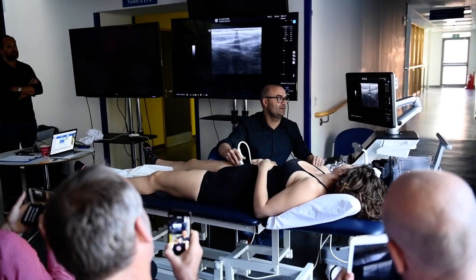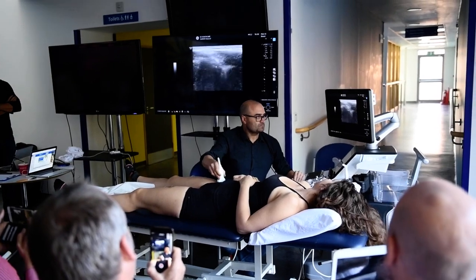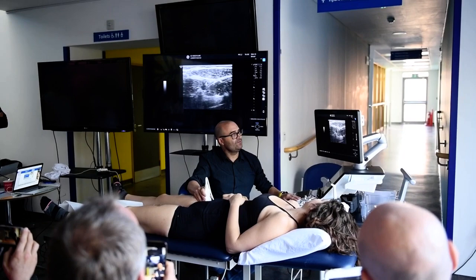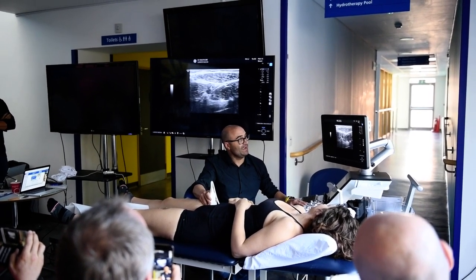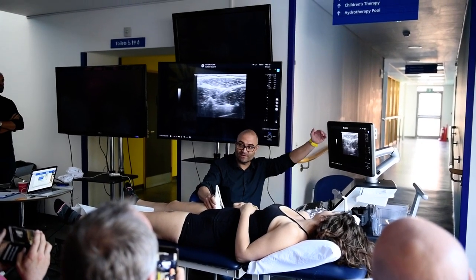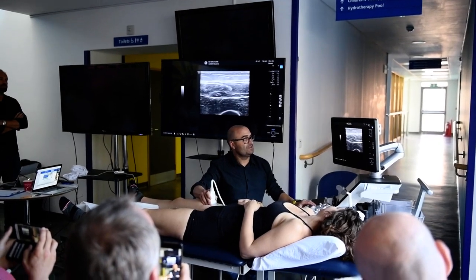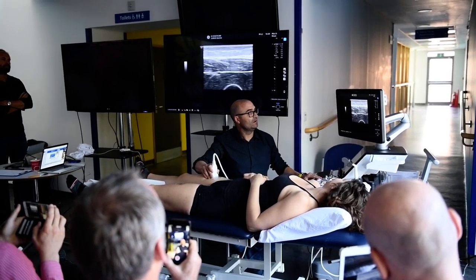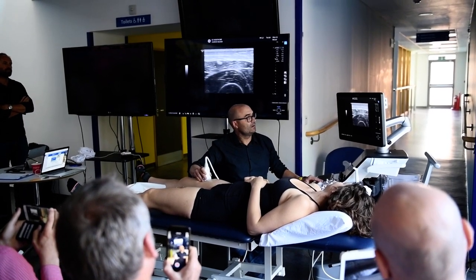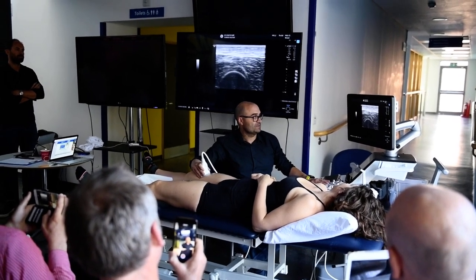We are going to test it here later. So if we move a little bit distal, here is where we can find the fluid of the conjoined tendon, and just above here is where we can find the fluid of the superficial fascia injury. Let's move down. You can see the central tendon, the scar of the central tendon. Moving down — rectus femoris, vastus lateralis, vastus medialis, vastus intermedius.